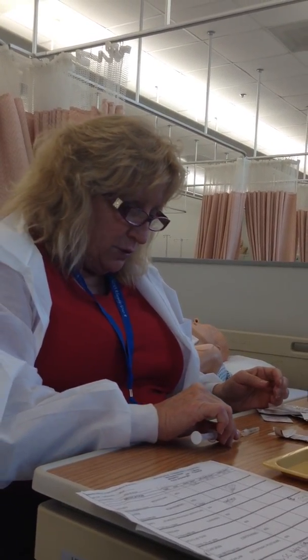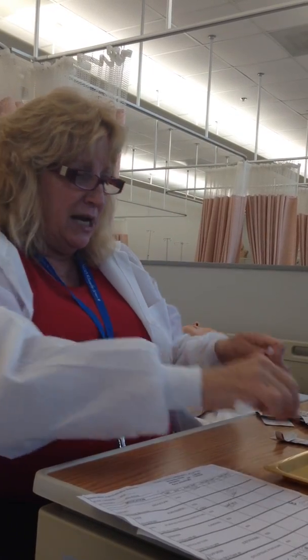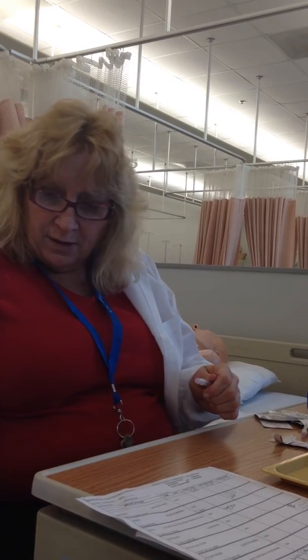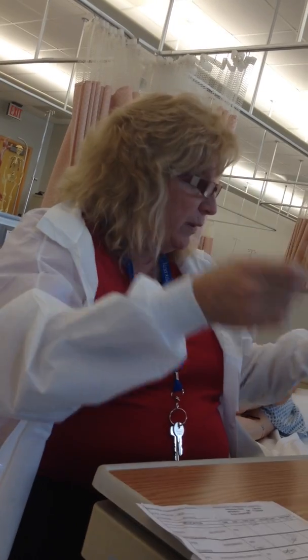This is the only time you recap, and you do it by the swoop and the scoop method. And I'm changing out my needle because it's been in here, and we want a clean one to go into the patient with the Z-Track.